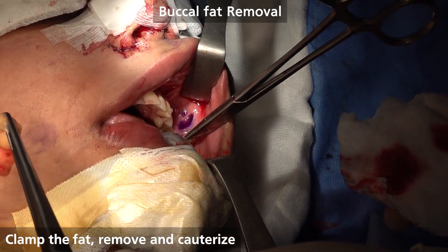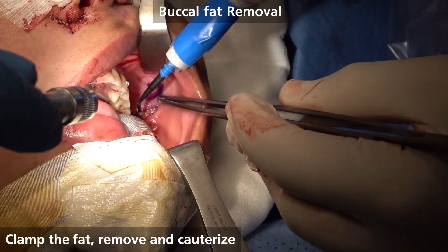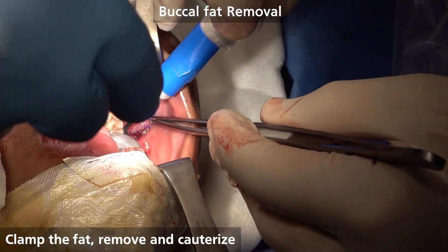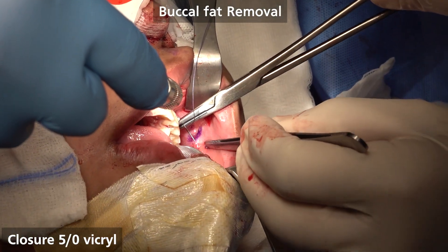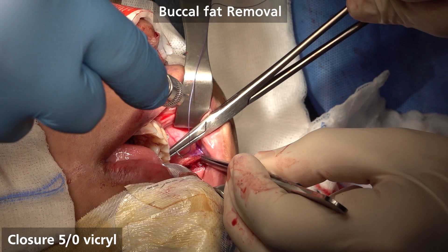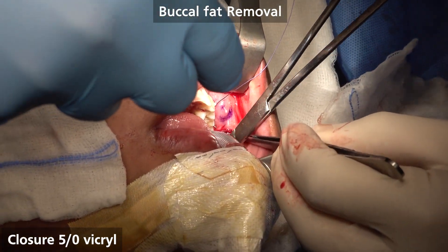You see, very nice — remove. Very nice, remove. On the left.